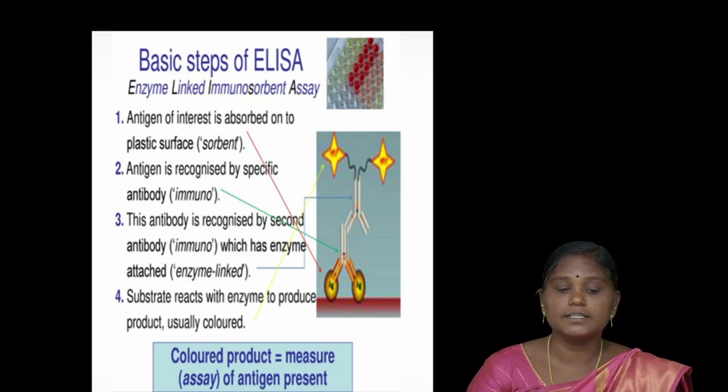This substrate reacts with the enzyme to produce a product, usually colored. The colored product is measured as the assay, quantifying the antigen present in the biological sample.